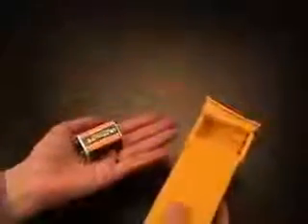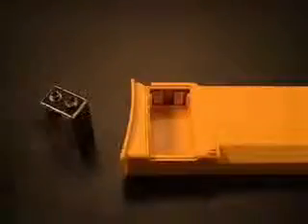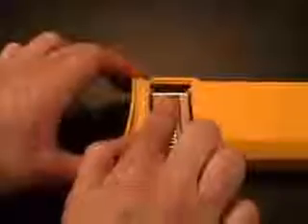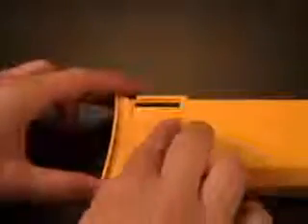The ASI is powered by a 9-volt battery located in the battery pack. To access the 9-volt battery, remove the 9-volt battery door by pushing on it sideways. Remove the 9-volt battery by gently tapping the battery pack. Insert a new 9-volt battery so that the contacts on the battery touch the contacts in the 9-volt battery compartment. Replace the 9-volt battery door by placing it in the almost closed position and pushing it closed.